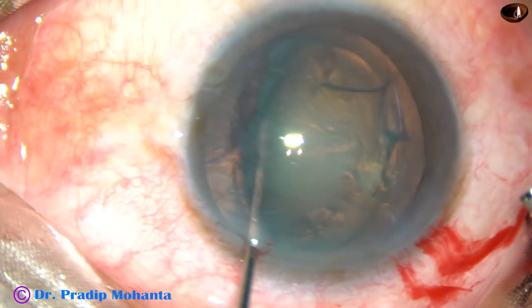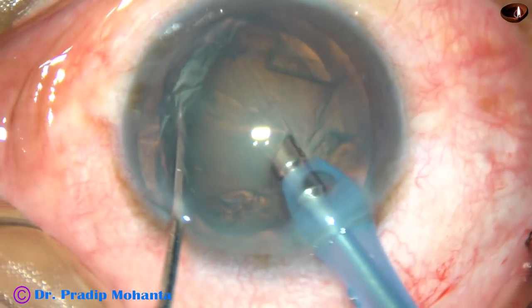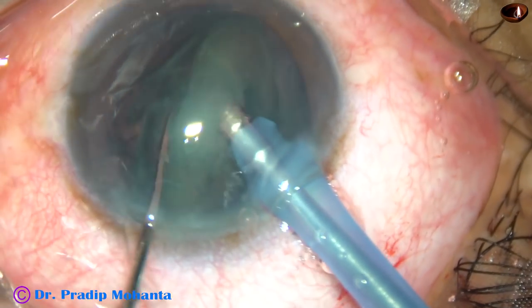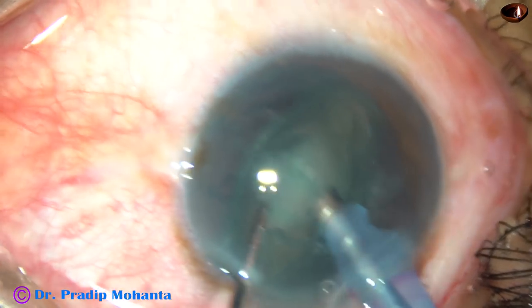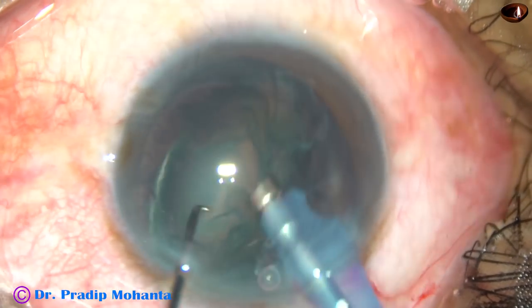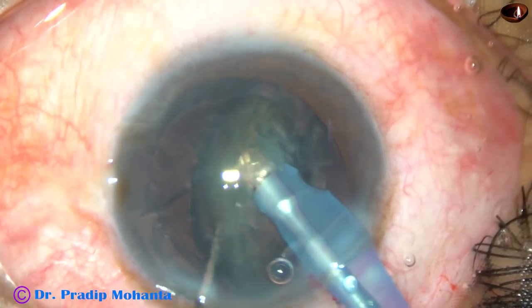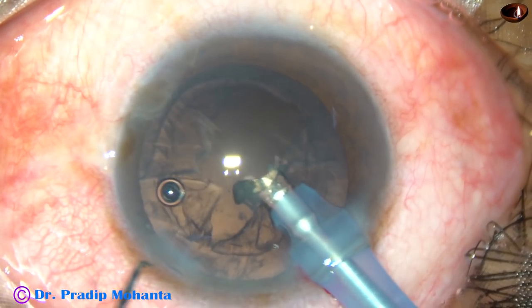I am going to support the other surface of the lens like this. Now I introduce the tip of the FACO handpiece, face the nuclear mass and make this cut, then an adjacent cut, then on-mode. And thus I remove this portion of the nucleus. Now I crush this lens between two instruments and divide it into two parts. The inferior part is being emulsified and removed. Very minimal ultrasonic energy is being used to emulsify this lens matter. And this is the last portion of the lens mass — yes, the nucleus is managed.